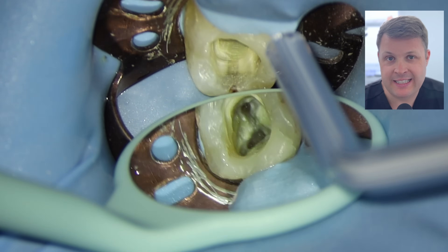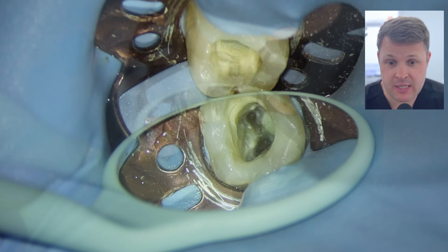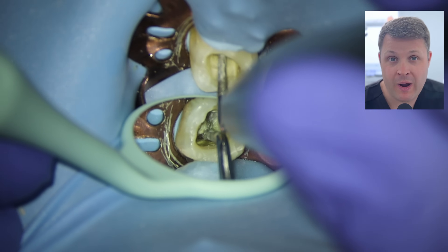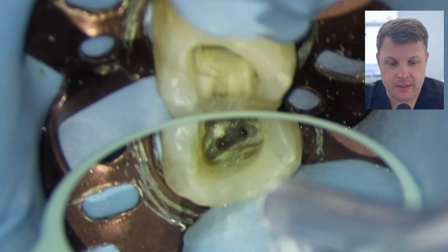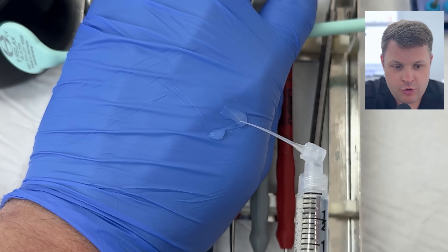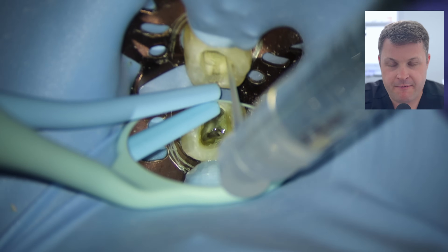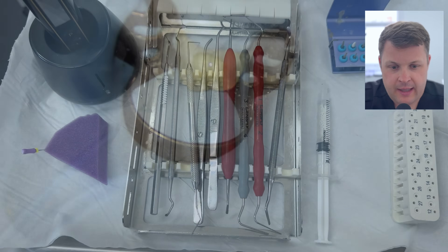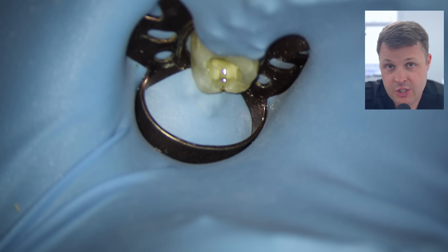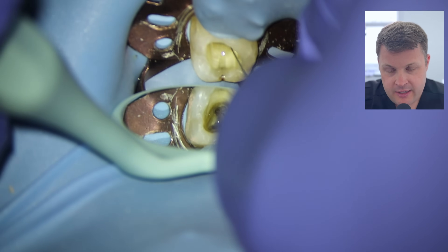When we look, the distal now looks pretty good but the mesio-lingual needs a little more attention. I'm going to use these Endosuccess burs — they're diamond-tipped and the great thing is you can see the tip while it's removing the dentin. Once the mesio-lingual has been refined it's not perfect, but it's a start. We're ready to irrigate using this side-venting Irriflex tip, filling the cavity with irrigant. I'm slightly worried about calcification in the distal root, so I'm moving straight to a size 10 D-finder.